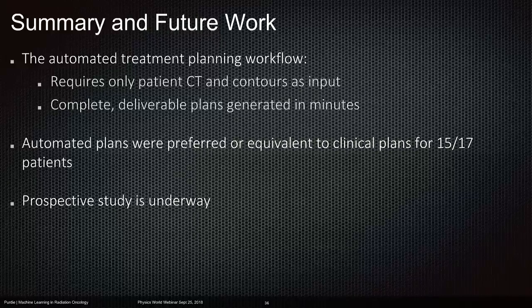Yeah, so I can answer on the automated machine learning plan. For each plan, it would be 1 minute roughly for the machine learning part when you apply the model, and then it would be the optimization time, which would be for a VMAT maybe 3, 4, 5 minutes, depending on the size of the case. That's when applying, so that's when you run it. And of course, the training can take hours and hours, but it's done offline, so it can be on standalone hardware, and it can be done over weekends or evenings and so on. So when you actually run it online, it should be in a matter of minutes.